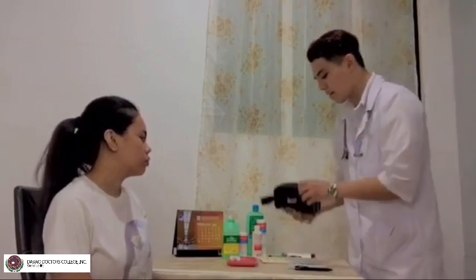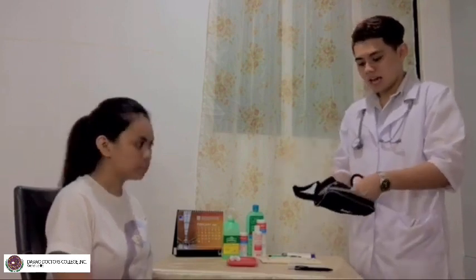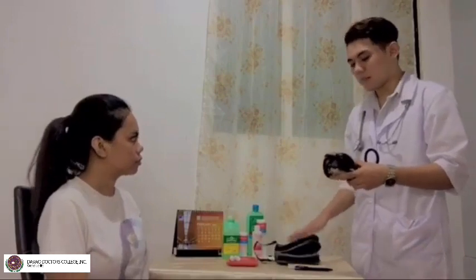So, we need to ensure that the equipment is intact and functioning properly, and check the cuff size and leaks in the tubing between the cuff and the sphygmomanometer. So, this is a new sphygmomanometer, and I have already checked this one. There are no damages and leaks. So, this is now ready to use. And also, this is appropriate for the patient's arm.